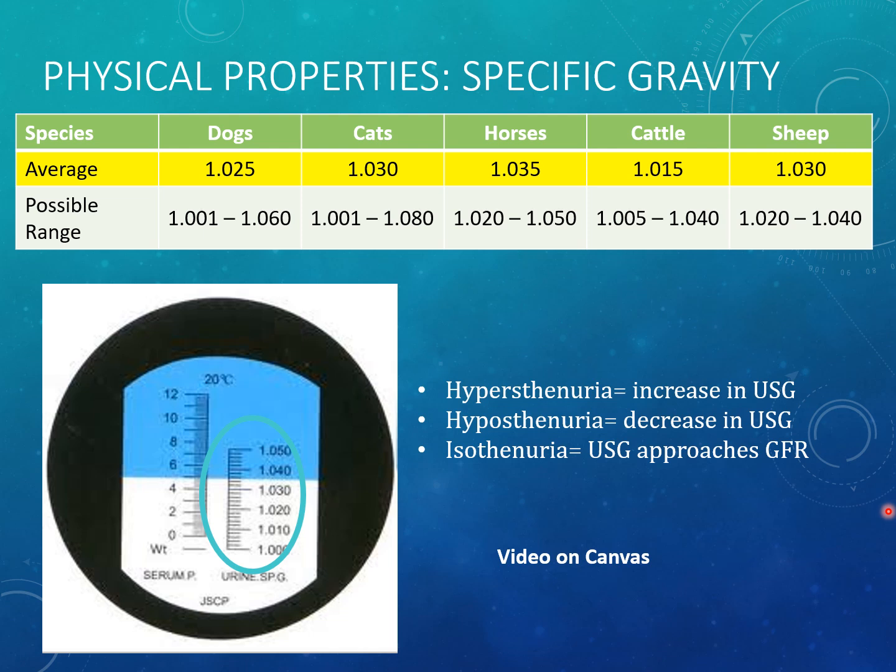And then a low or decreased specific gravity, where we have a dilute urine and the stuff in it is very low compared to the amount of fluid, could be related to increased water intake, excessive fluid administration, pyometra, liver diseases, certain renal diseases as well, and diuretic therapy.